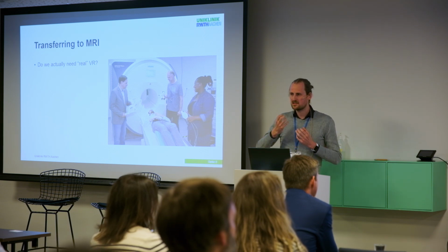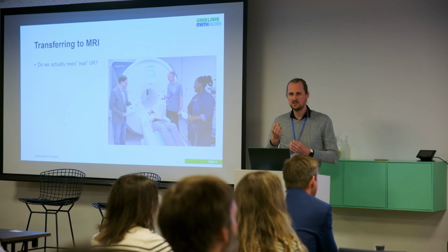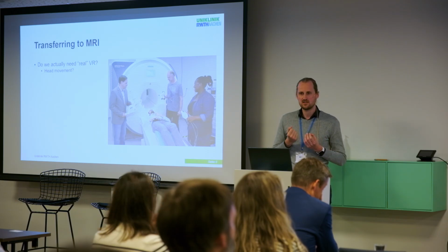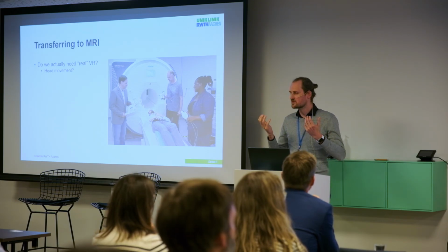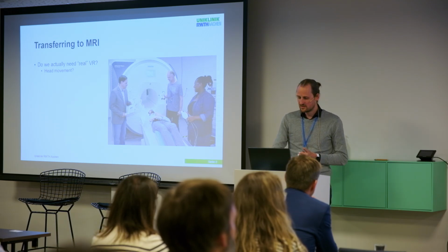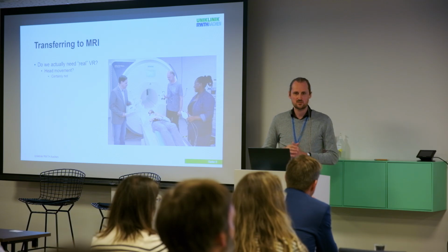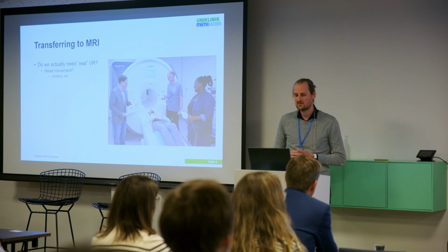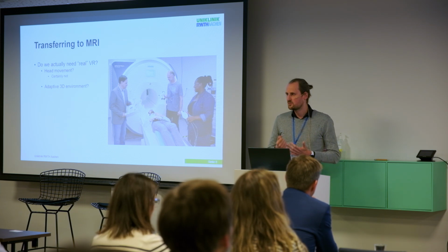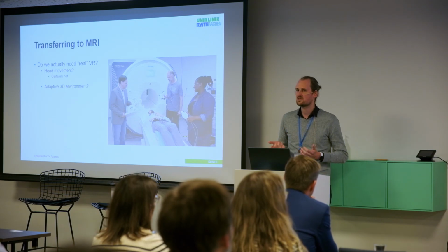Do we really want to mimic it at the same level as we did with our HTC Vive? And then I thought, what really makes for VR? What are the key factors there? So we know that a key trigger for immersion in VR is this correlation to head movement. You can move your head and your visual field will shift with you. Head motion in fMRI, I personally try to avoid it as much as possible, so this factor we didn't really need. A second factor is this option of having a three-dimensional environment, like this adaptive 3D space, which you can move through, either with a keyboard or actually walking, while able to make immersive environments. This was also not really relevant to our task.